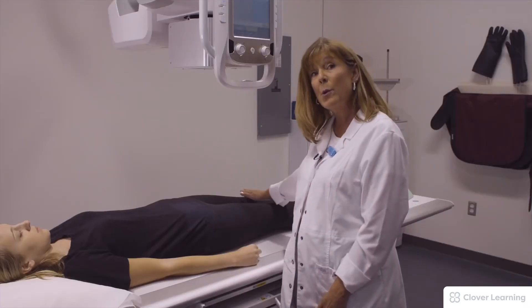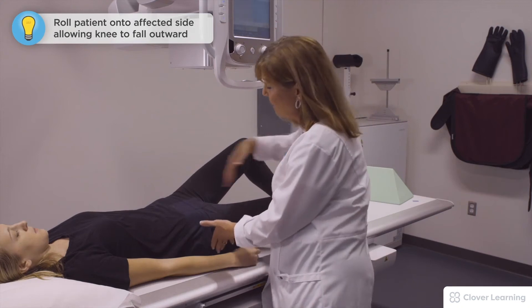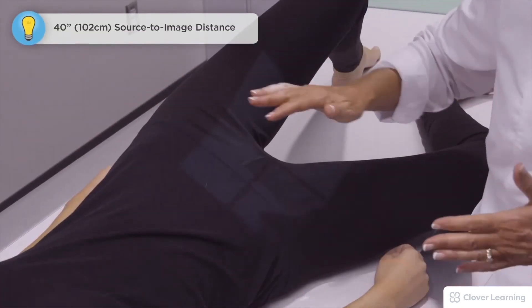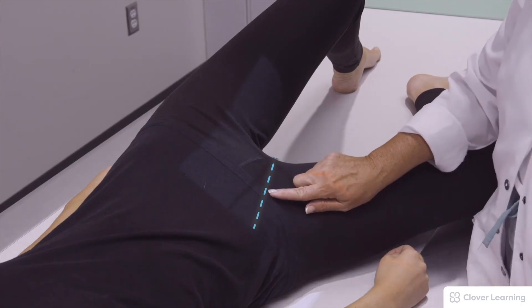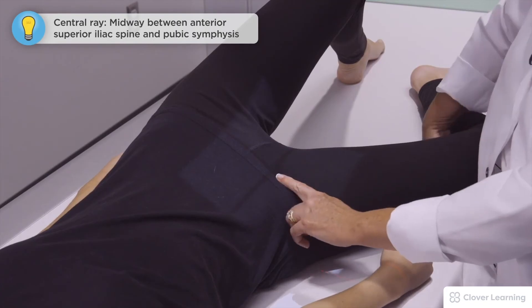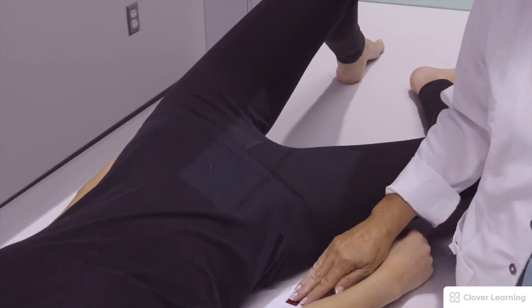I'm going to have the patient bend both knees. I'm going to let her right leg fall open towards the affected side and roll her through the hip just a little bit. We're going to use that same plane from the ASIS to the pubic symphysis but center right on the plane this time. The central ray is right at the crease or fold of the leg. We're going to keep that collimation at 10 by 12 and use the right marker here in the light.